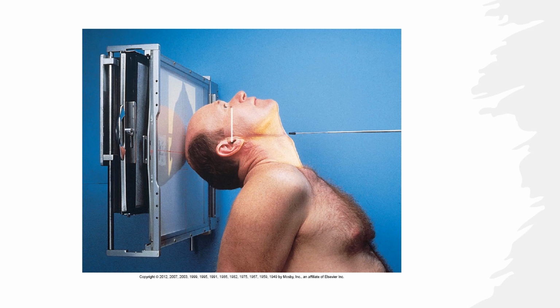Okay? So I'll walk through that again. If your patient can't tip their head back this far, then the IOML is not going to be vertical. It's going to be leaning out toward the X-ray tube. Okay? Well, if you look at the central ray indicator to the IOML on this image, it's a perpendicular relationship. Okay?